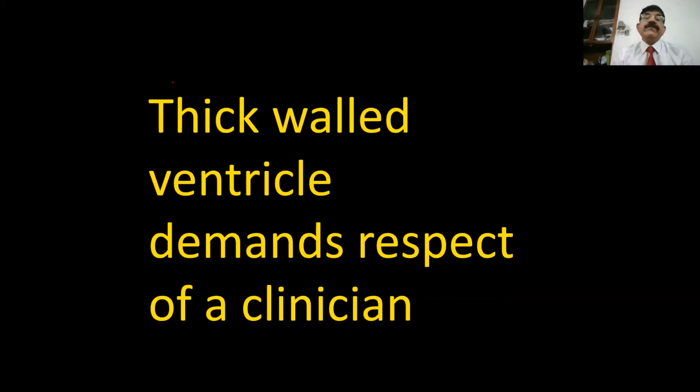True. And so there is a request from Dr. Rohit Tandon, who wants to know again about GLS in hypertrophic cardiomyopathy. As I know, GLS does help, particularly, let me add in Fabry, the hypertrophic segments have a normal GLS, as compared to hypertrophic cardiomyopathy where the GLS is abnormal in the hypertrophic segment. Yes. So remember three things.